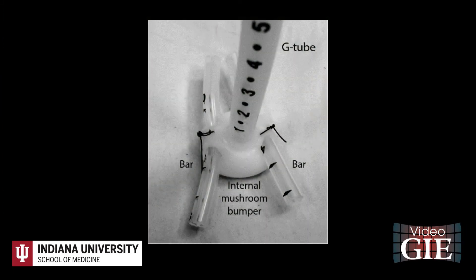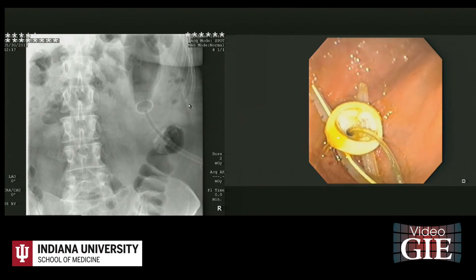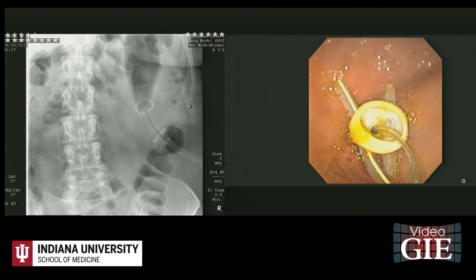Two bars were manually created by cutting two segments of an 18-French silicone J-tube. These bars were manually added and sutured to the internal mushroom bumper of a new 24-French G-tube, increasing its surface area. This was lubricated and passed over the guide wire through the mouth and into the stomach, pushing out and replacing the buried G-tube.